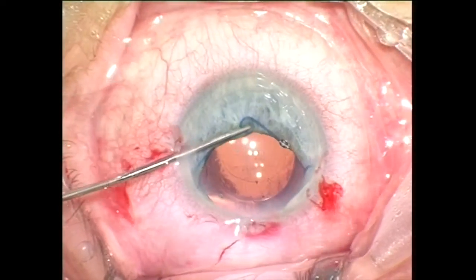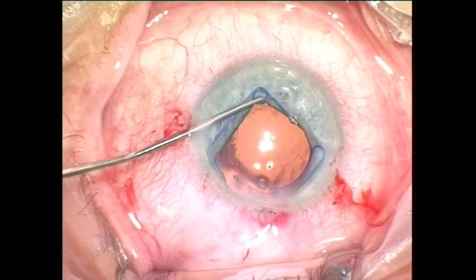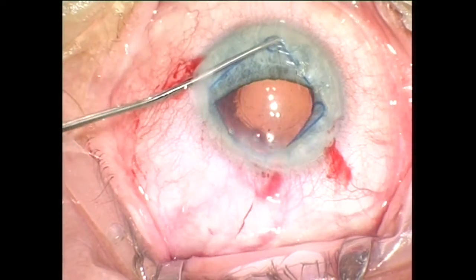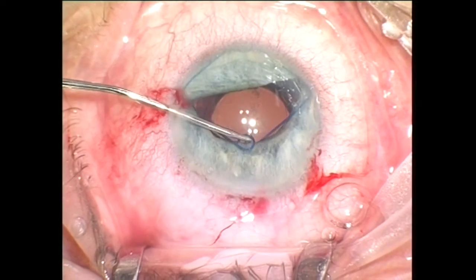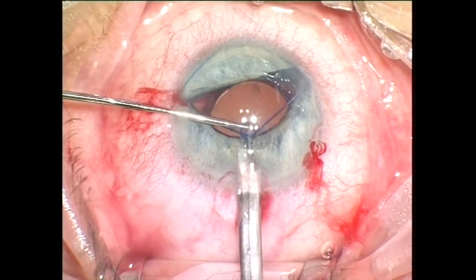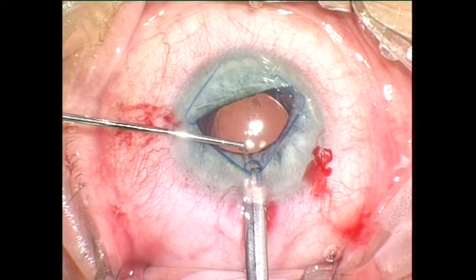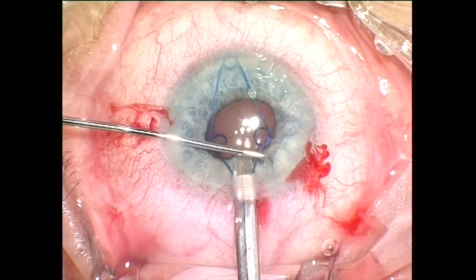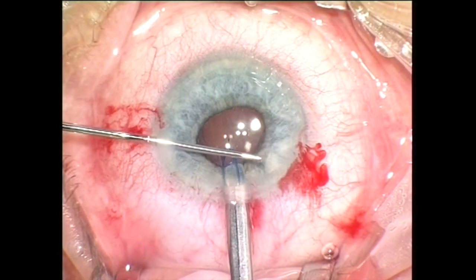Due to the improved biomechanical properties, the new version of the Malugin ring is not only easy to implant, it is much easier to remove from the eye. First I disengage the distal scroll followed by the proximal scroll. Now it is lifted above the iris plane, positioned on the foot plate, and caught by the injector hook. By sliding the thumb button back, the ring is retracted. A second instrument is used to assist both lateral scrolls to enter the injector tube.